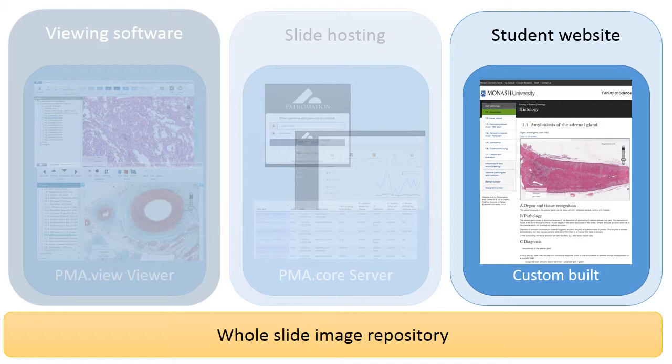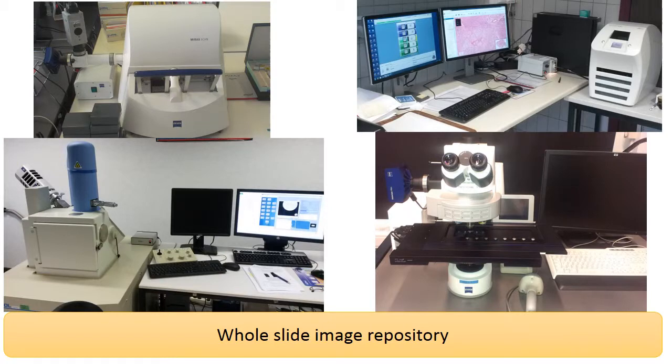We've received great feedback from students ourselves who tell us that they really appreciate a user-friendly guided online tour into histology or pathology. Your first endeavors into digital microscopy education are still the digitization of your existing content and slide collections. You have to get your slide repository built. You should start with a chapter or two and gradually expand the collection over time.